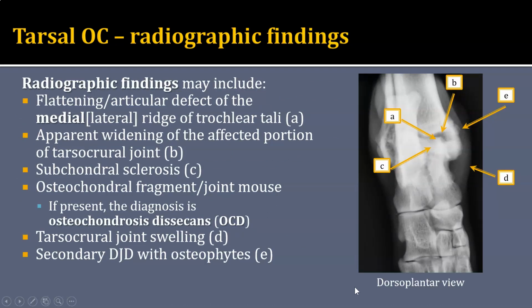This slide lists all of the radiographic findings that we will assess for, and this lesion is best identified on the dorsal plantar view.